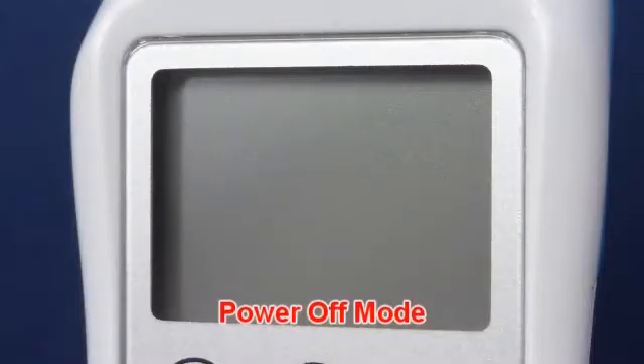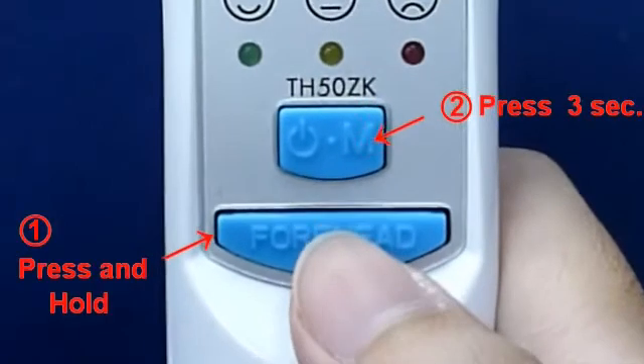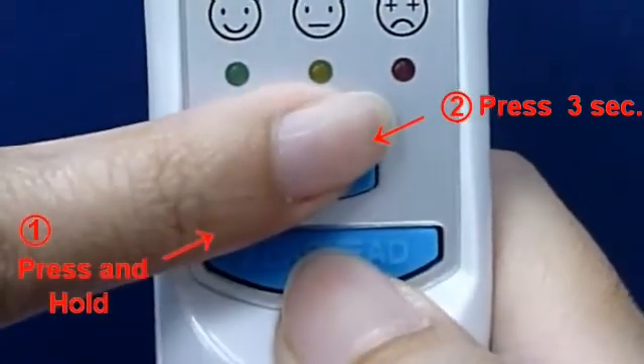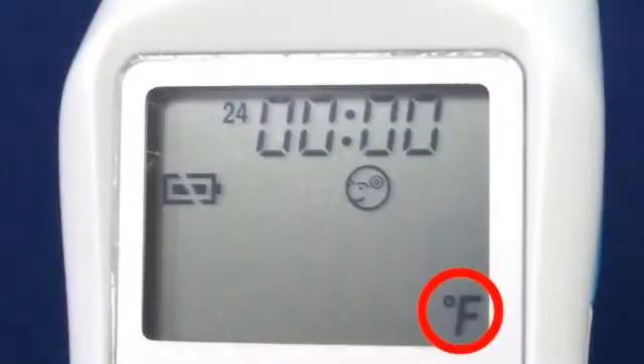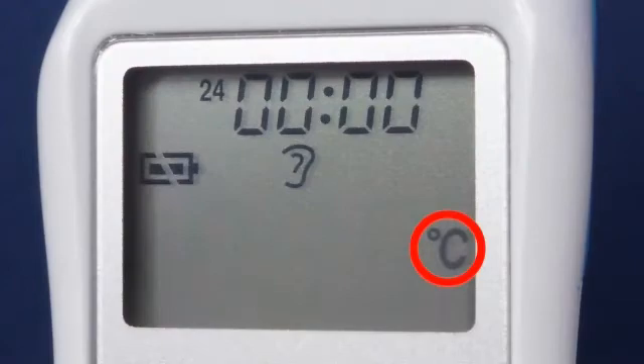In Power Off Mode: press and hold the Forehead Button, then press the On Memory Button for three seconds. You may use the same process to change from Fahrenheit to Celsius.